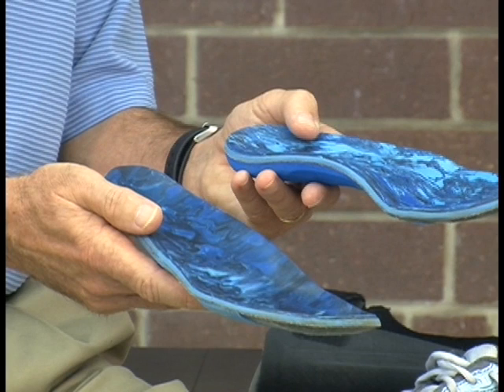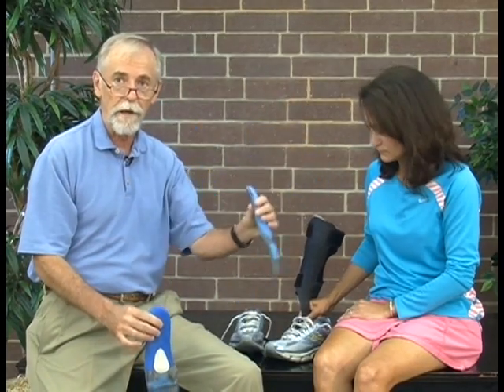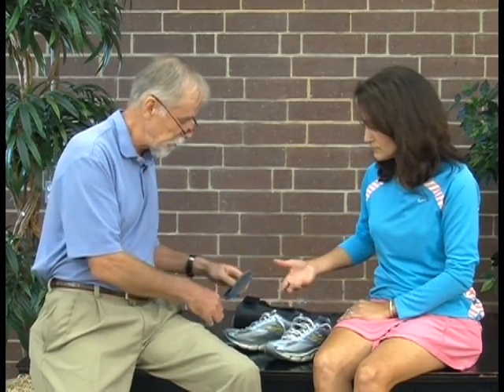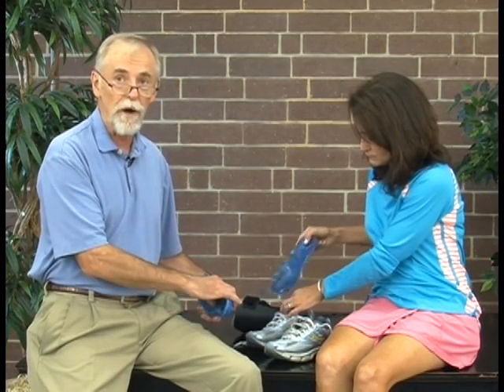One of the first things we did to help compensate so that the brace would work effectively and fit well was to make some custom orthotics for Beth. These have been tweaked a few times since we first made them. We first made them with just a correction for the leg length difference, so this one is quite a bit thicker than this orthotic. We did find that as she ran she puts a fair amount of pressure on her forefoot, so we added a little additional padding to this one as it got worn down. This is on the good side, where she's getting even a little more push-off than on the brace side.